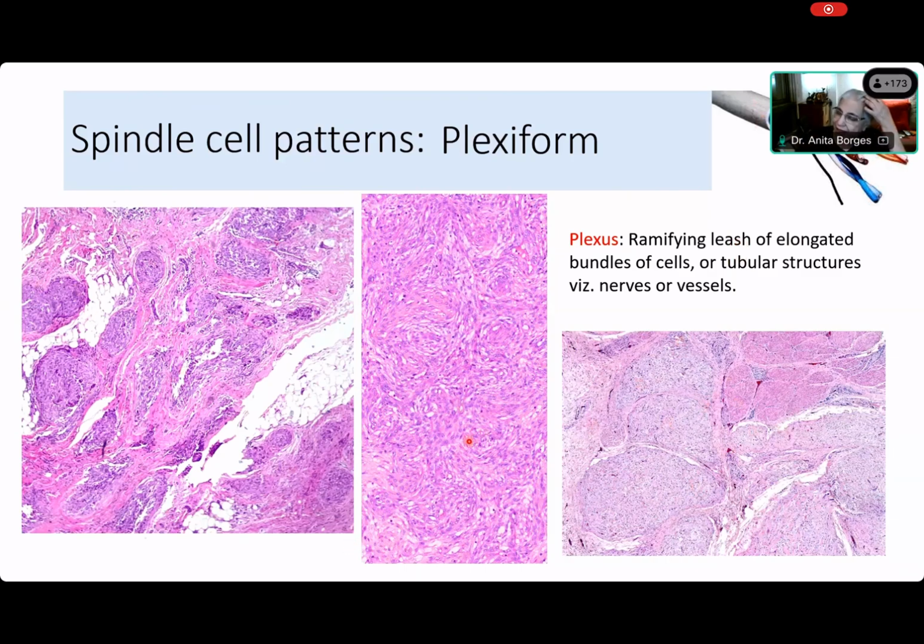Yes, you see it in any elongated structure. Once again, it doesn't have to be a spindle cell. It can be a plexus of axons. It can be a plexus of nerves. It can be a plexus of blood vessels. All that you need is a long structure.